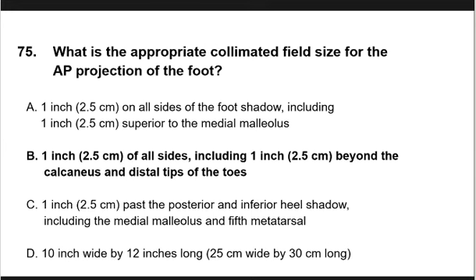Ano na ang tawag doon? That is AP axial projection of the foot pag naka-angle ng 10 degrees or more. Pero kung ang i-demonstrate natin AP projection of the foot, ang niro-rule out lang ay phalanges and metatarsals, then the central ray is just only perpendicular or vertically directed. Okay, so that is number 75.